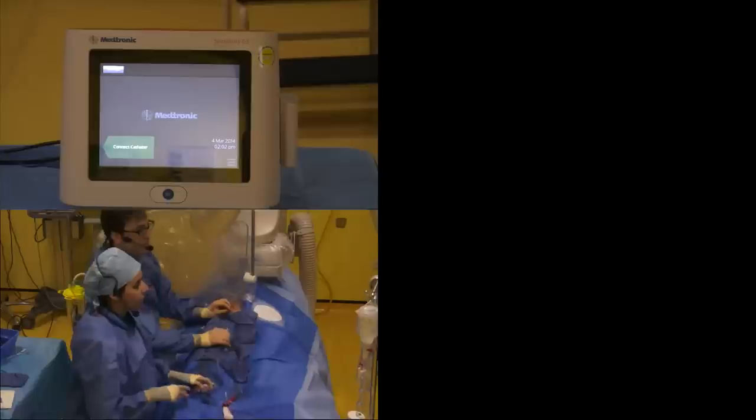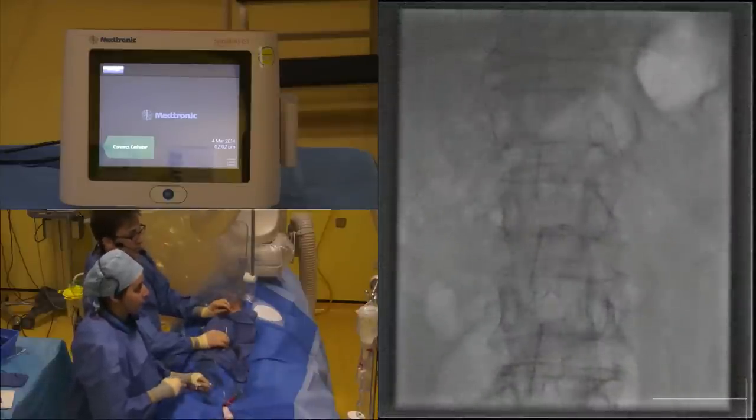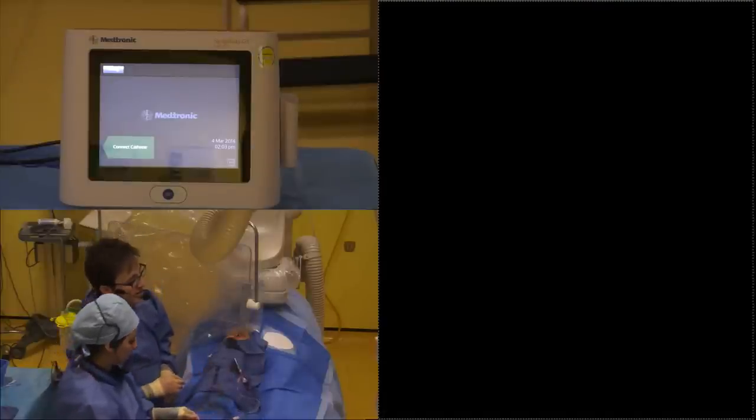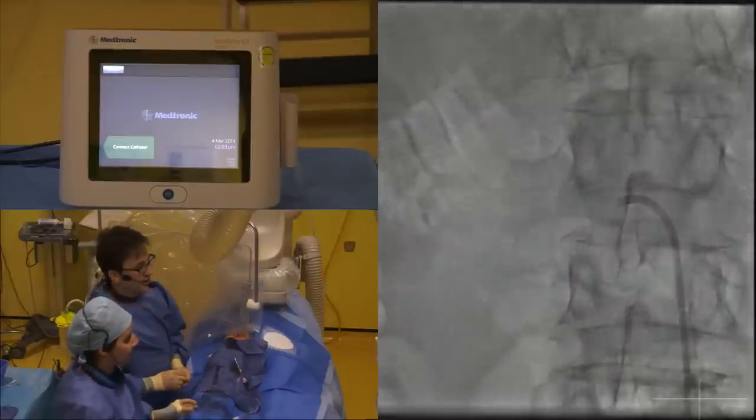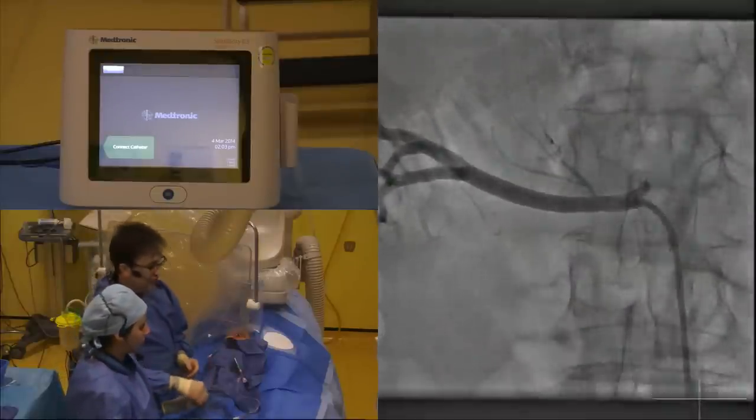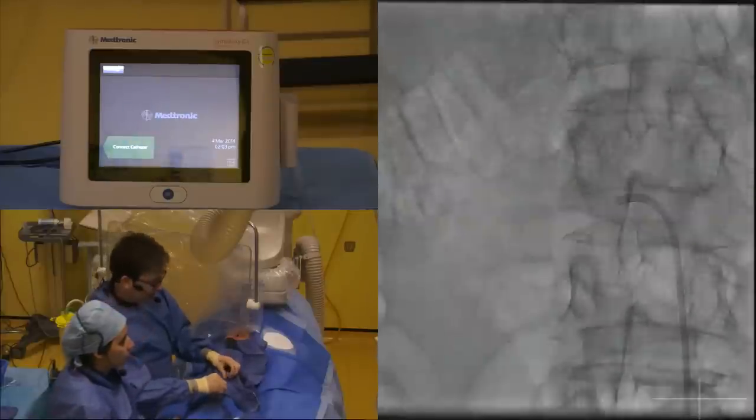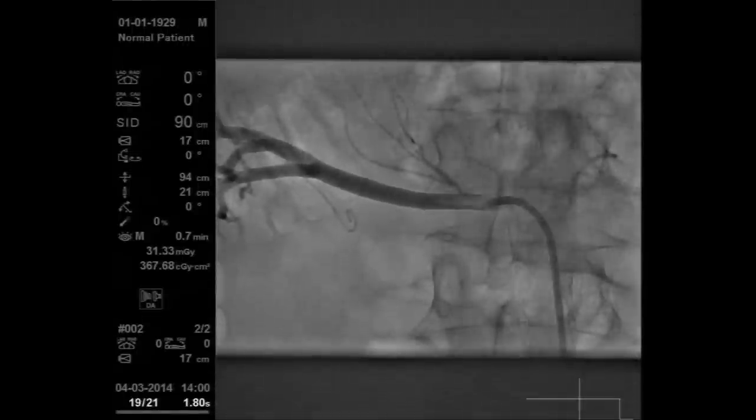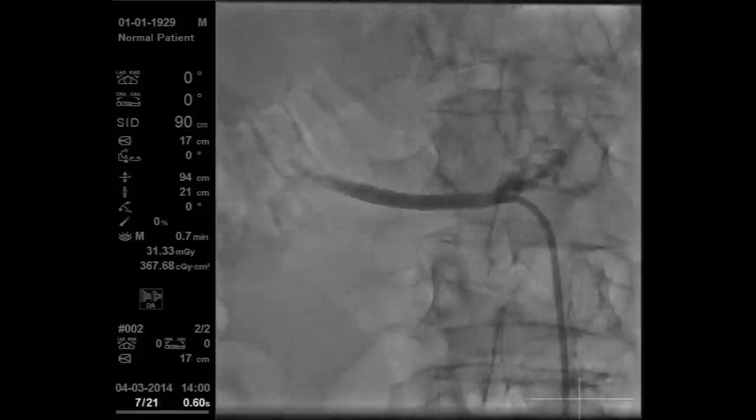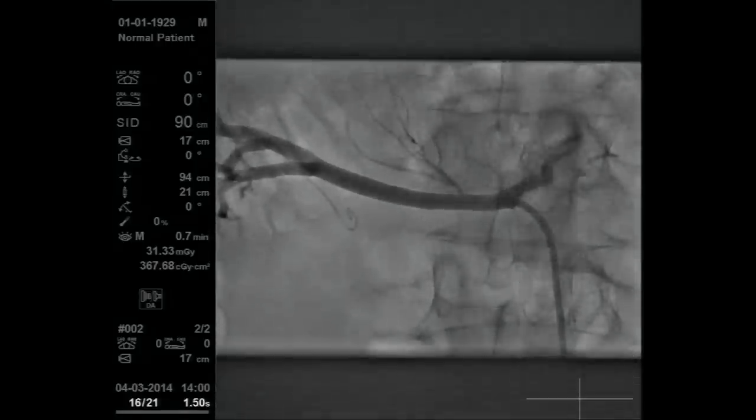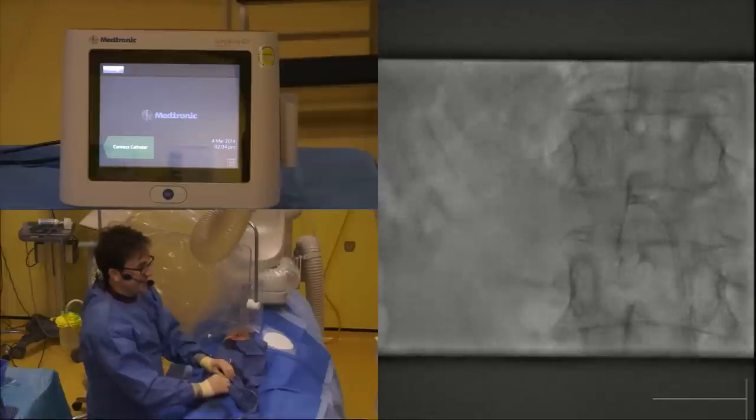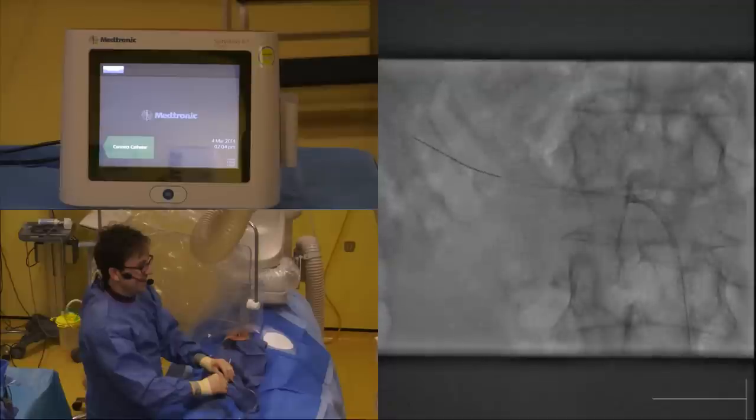We've given some heparin. I'm just going to intubate this vessel now. Just inject for me now, Ash. I've given some nitrates as I said. I'm going to take an angiogram image. Often the case when you take an angiogram picture, you see that you've been deceived from the initial aortogram. The vessel looks a good caliber, about three, three and a half millimeters, so it's suitable for this procedure. This is the case you have to select if you are a beginner?